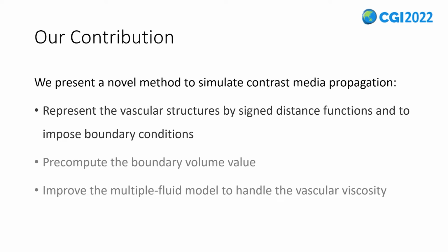We pre-compute the boundary volume of the intersection area to reduce the real-time computational cost, and generate a volume map to store the values and to query them in real-time simulation. Once generated, the boundary volume map can be reused in subsequent simulations without regenerating for every simulation, which greatly saves time and memory for initialization.